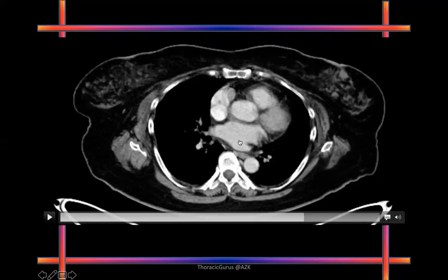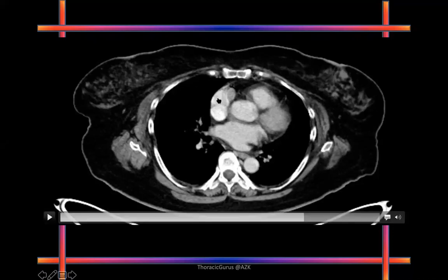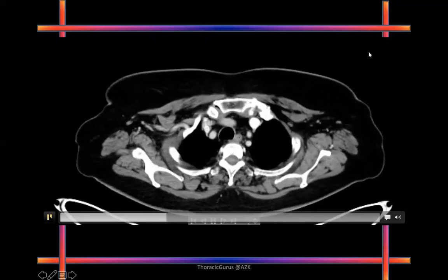I'll point and you tell me what it is, okay? Left atrium. What do you think this is? That will be the right atrium. What do you think this is? That will be the RV. And this? This would be the LV. What is the structure in between? That will be the aorta. Yeah, the aortic outlet. Very good. Easy? So far, so good?